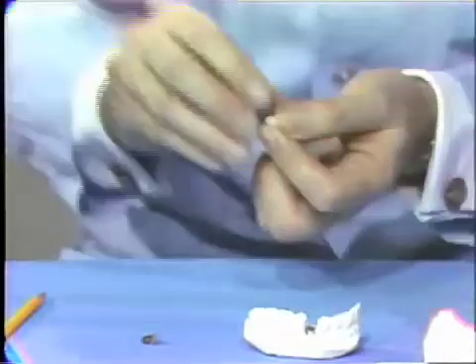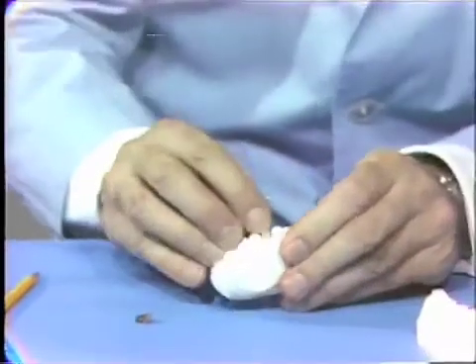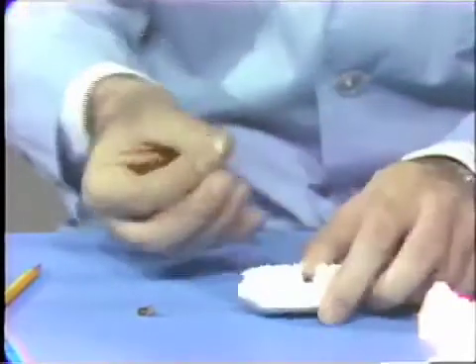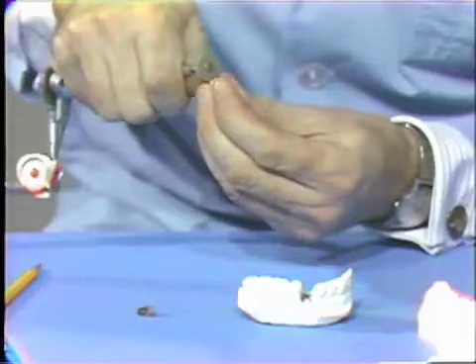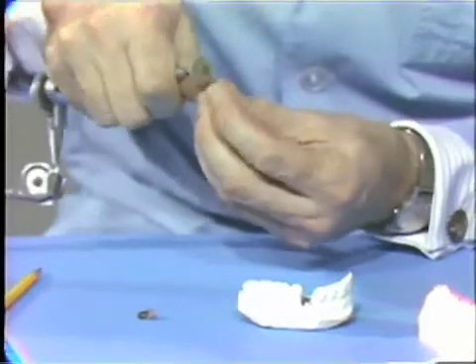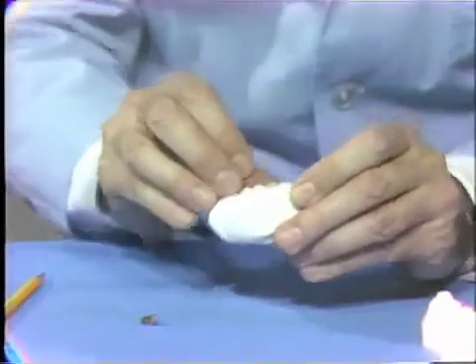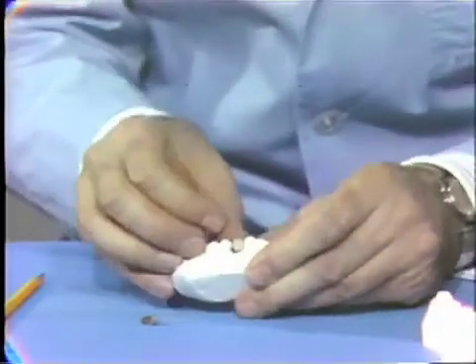So, return back again to the model, seated in position. And grind again on the marks. Now that's fine for the initial rough grinding.